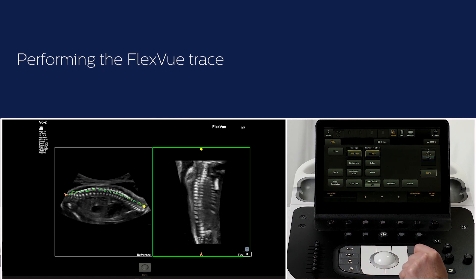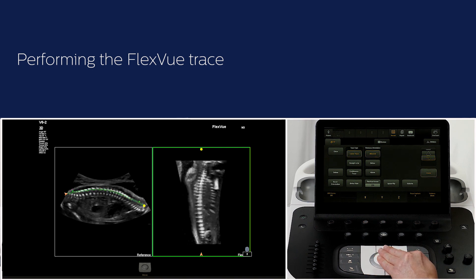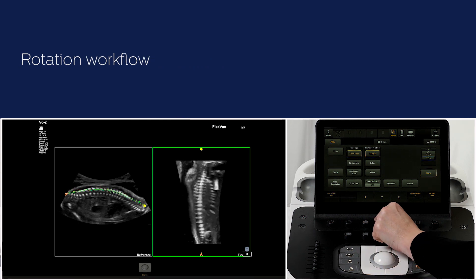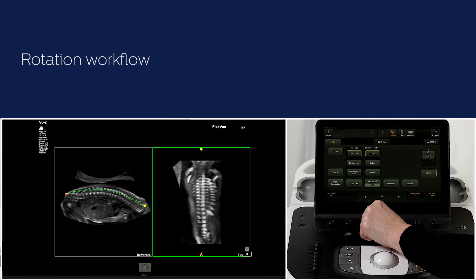The trace types straight and continuous trace will not have this trackball arbitration after setting the FlexView points. Once you complete the trace — curve, straight, or continuous — the trackball can now be used to move the FlexView trace through the anatomy. Use the X, Y, and Z rotary knobs to adjust your image if needed.